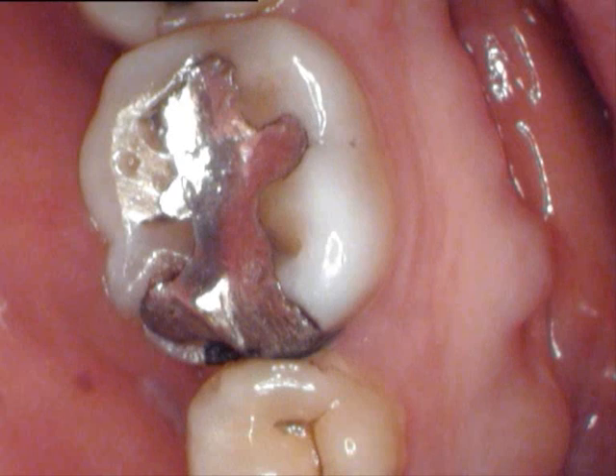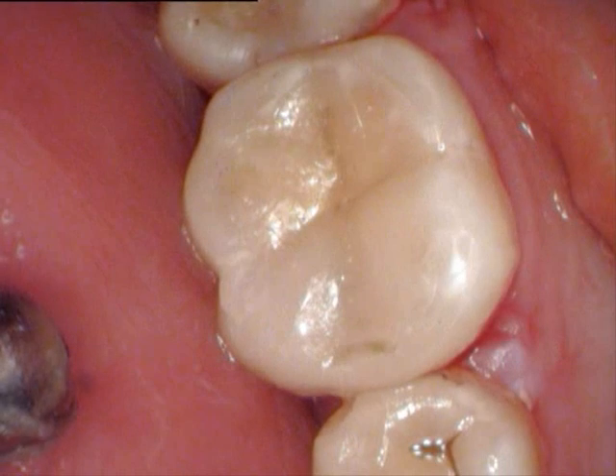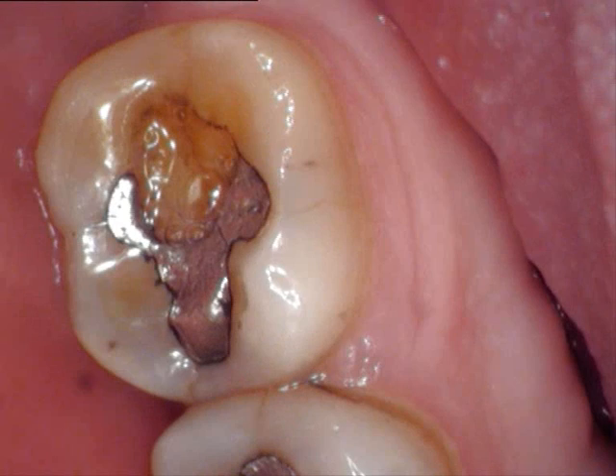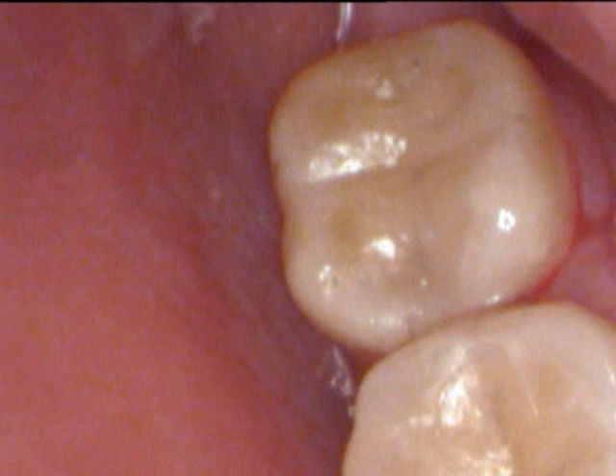Comparing where we started to where we're ending up: here's the amalgam filling with the damage and the decay on it, and here we see it completed and replaced with a white composite filling. Here's the worn amalgam no longer doing its job, and here we see it replaced with the composite filling.